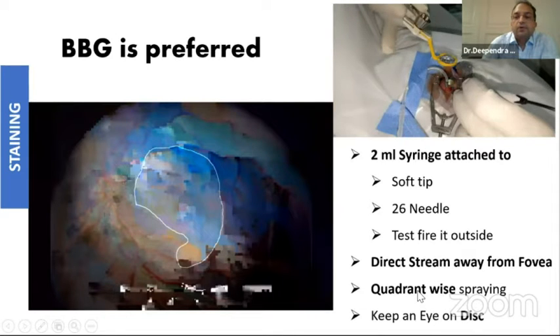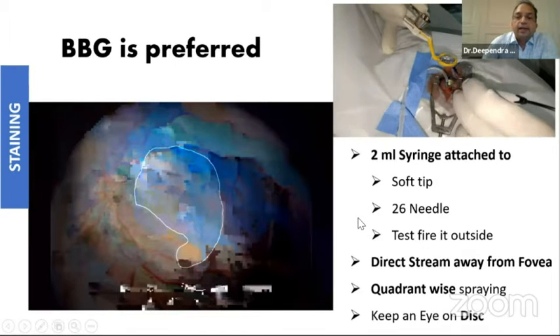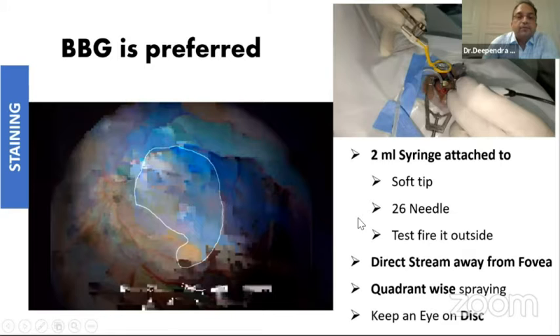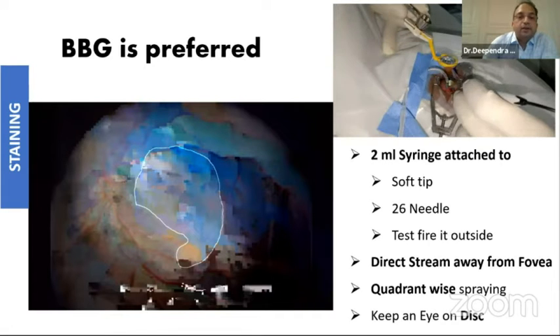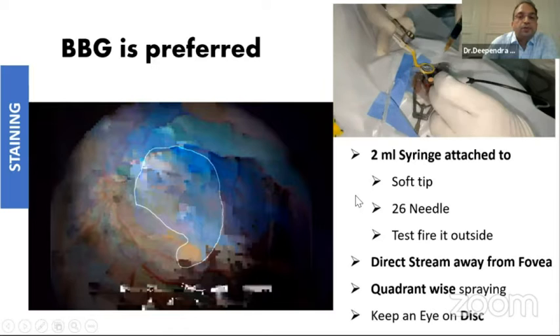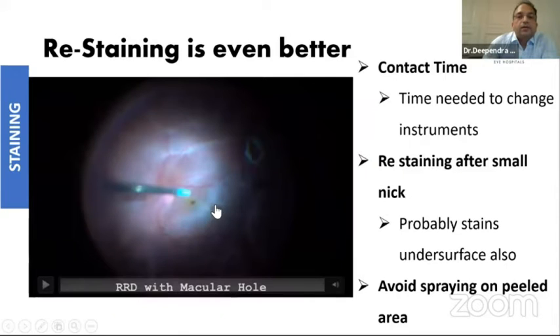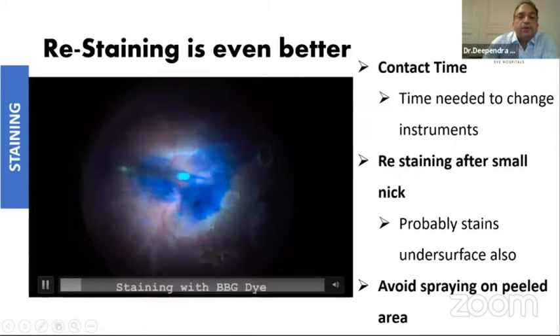Avoid the direct stream going to the foveal area — you don't want to damage the cells there. When you are injecting the dye, keep an eye on the disc. If you feel that your pressure is getting high or the disc is losing pulsation, be careful — your stream is probably going very fast and it can be dangerous. The injection should be smooth.